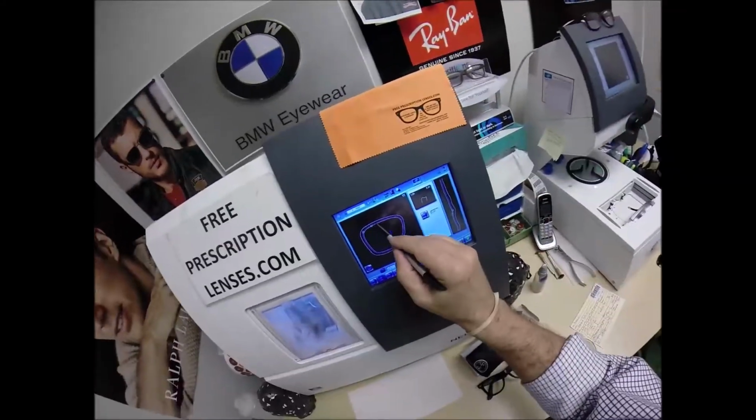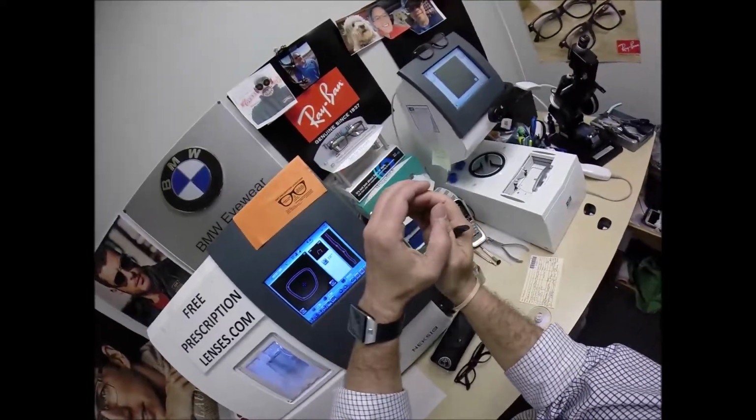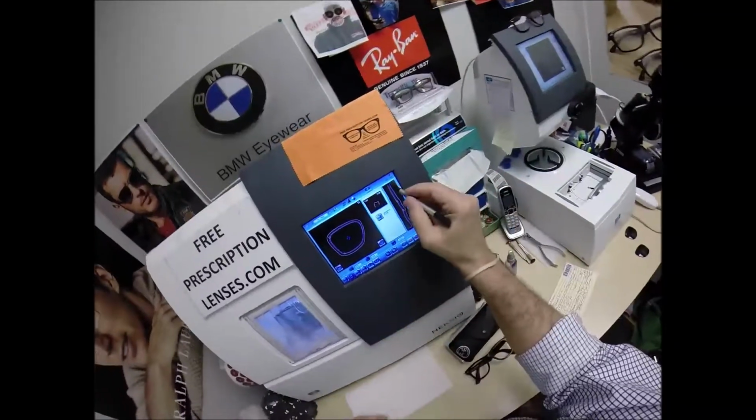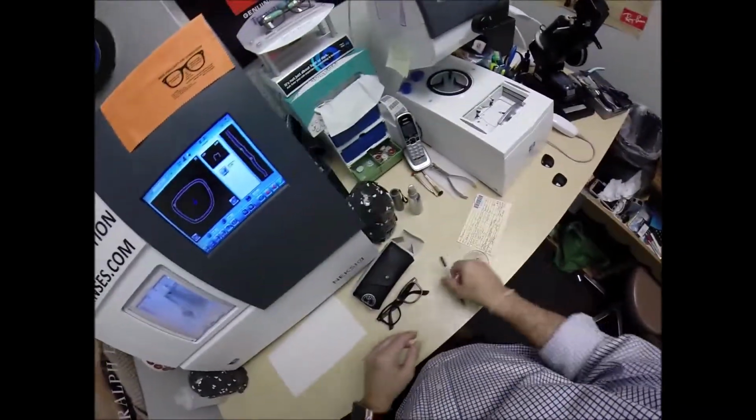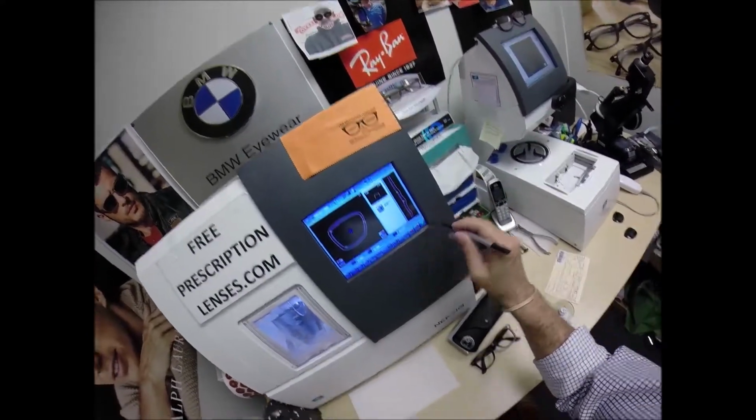This over here, when you see me moving everything around, that is if your lens was butterfly, even though it's round. If they were to cut it in half and lay it open straight, those are the thickness points on your lenses. That's something you normally don't see in my videos. So I'm going to hit the green arrow, which is start.